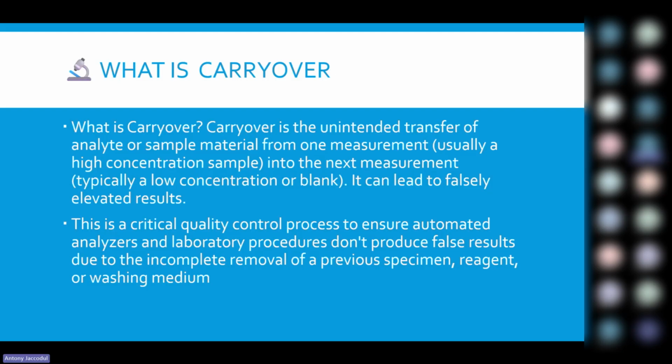This is critical in the quality control process to ensure that automated analyzers and lab procedures do not produce false results due to incomplete removal of previous specimen, reagent, or washing media.